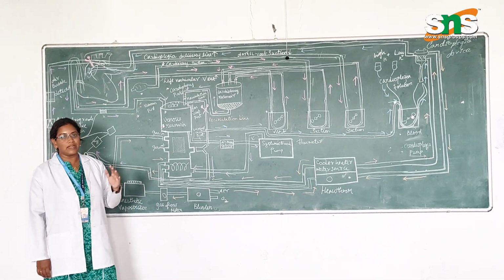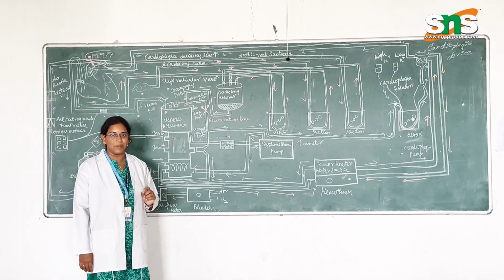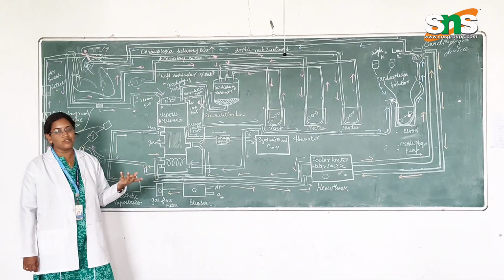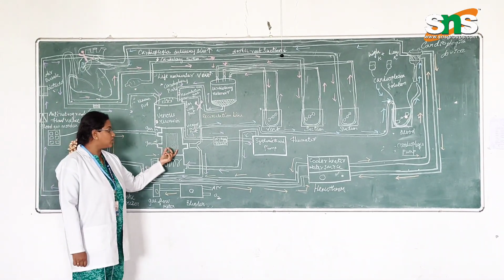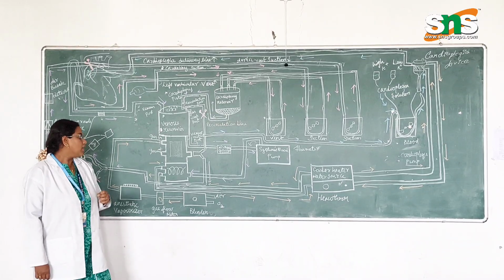The solution for an oxygenator failure is to change out the oxygenator at the bed of bypass. Though it is considered a very complex procedure, there is no other option, since we need to change the oxygenator to take over the function of maintaining the patient's oxygen level in the blood.